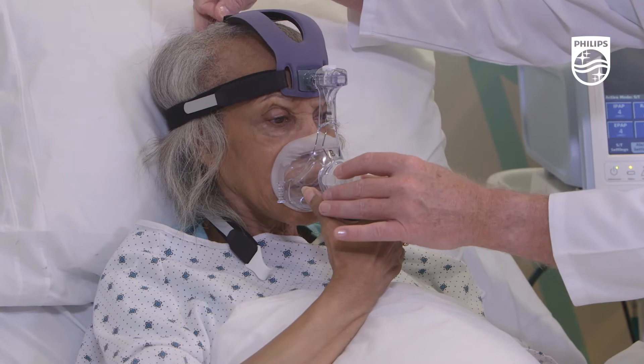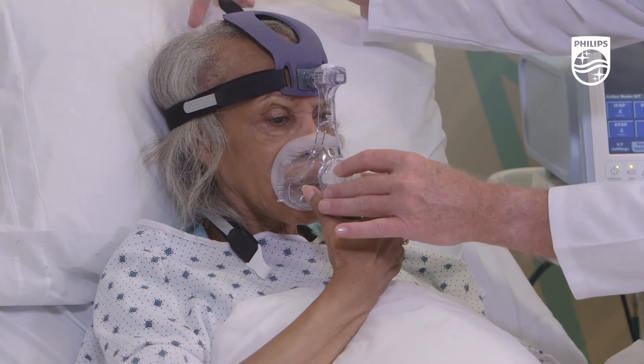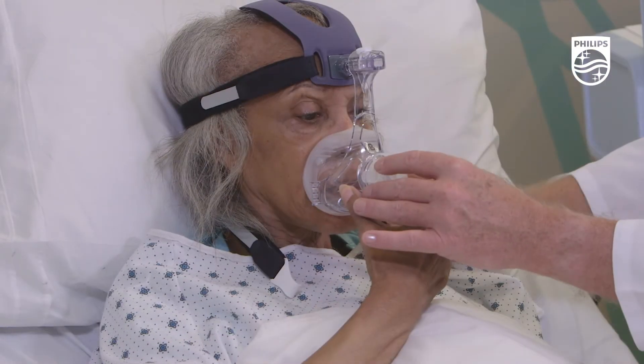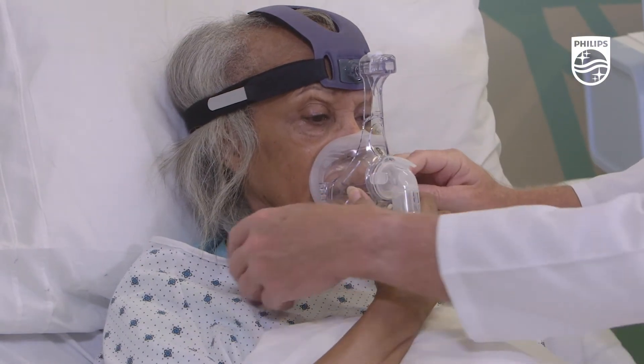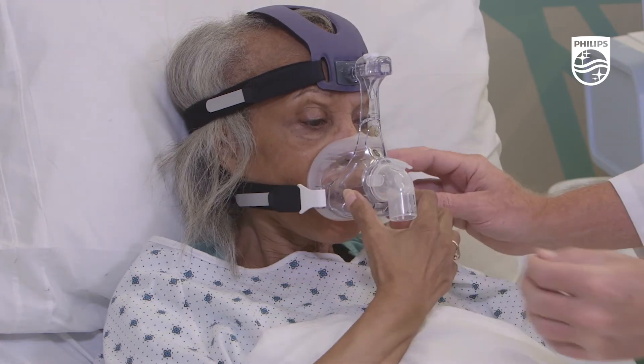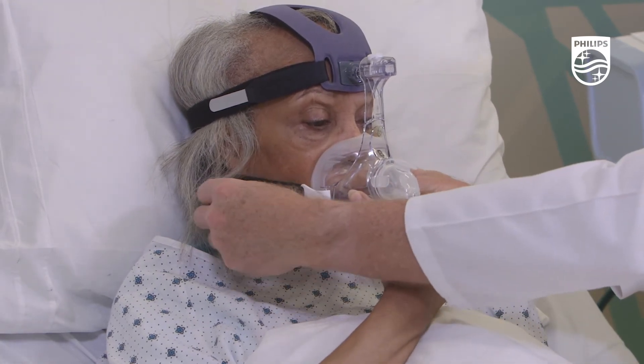You'll want to use the top strap adjustments to ensure that the upper head strap is in the optimal position vertically. Next, connect the lower talon clips to the mask frame and adjust the lower straps simultaneously, making sure not to over-tighten.